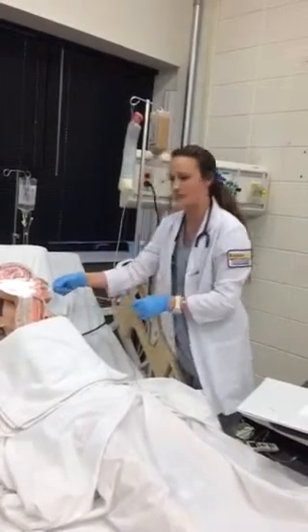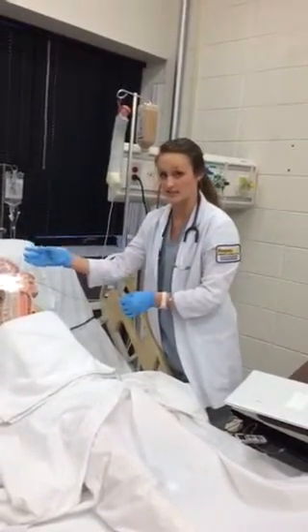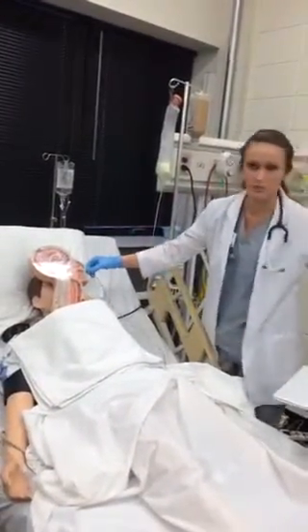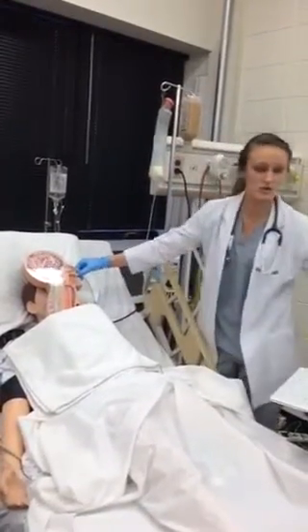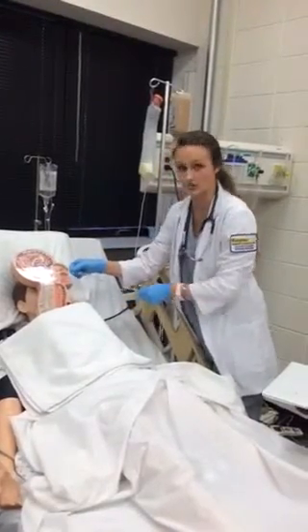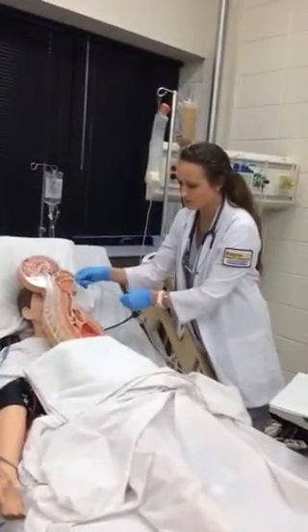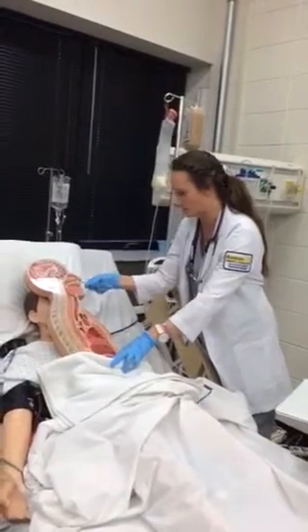Once I hit the back of the throat, the patient will give me that stop signal. And when I do insert, I want to make sure that the head is tilted forward slightly. And then once I insert it, they give me the stop signal, we'll take a break, and I'll give them the water. Once they've taken a sip of water, they're going to put their chin to their chest so that we can move the tube down further once they've swallowed it down. We're just going to slowly insert it until my marking.